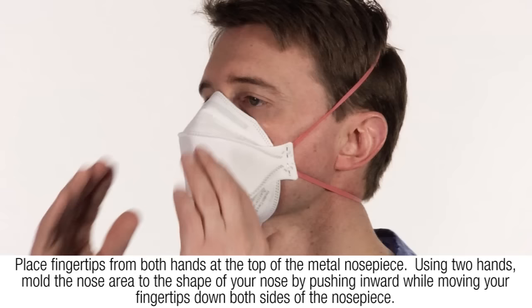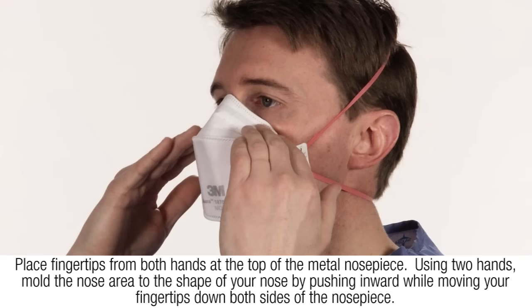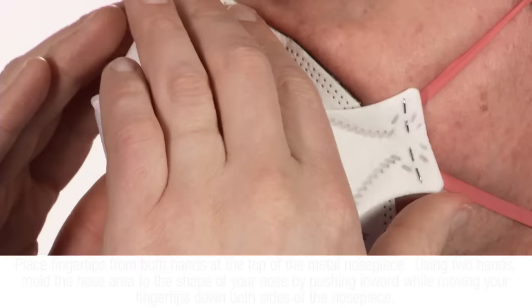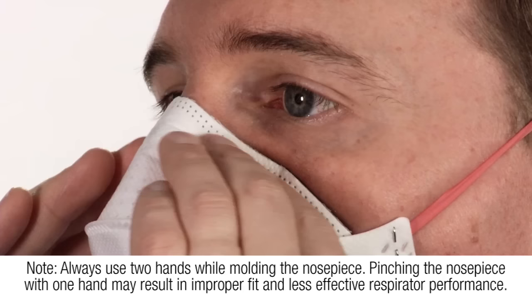Place fingertips from both hands at the top of the metal nose piece. Using two hands, mold the nose area to the shape of your nose by pushing inward while moving the fingertips down both sides of the nose piece. Always use two hands while molding the nose piece.